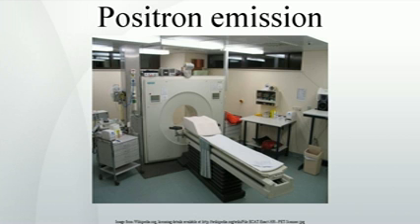Nevertheless, in recent years a few on-site cyclotrons with integrated shielding and hot labs, automated chemistry labs that are able to work with radioisotopes, have begun to accompany PET units to remote hospitals. The presence of the small on-site cyclotron promises to expand in the future as the cyclotrons shrink in response to the high cost of isotope transportation to remote PET machines.